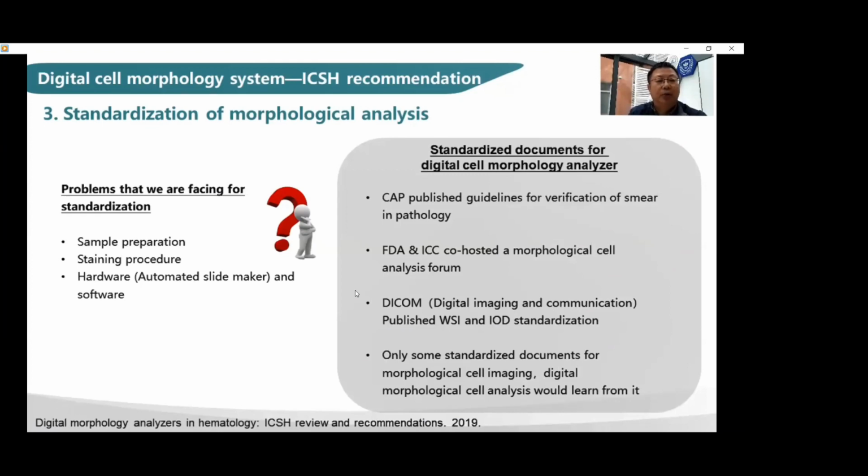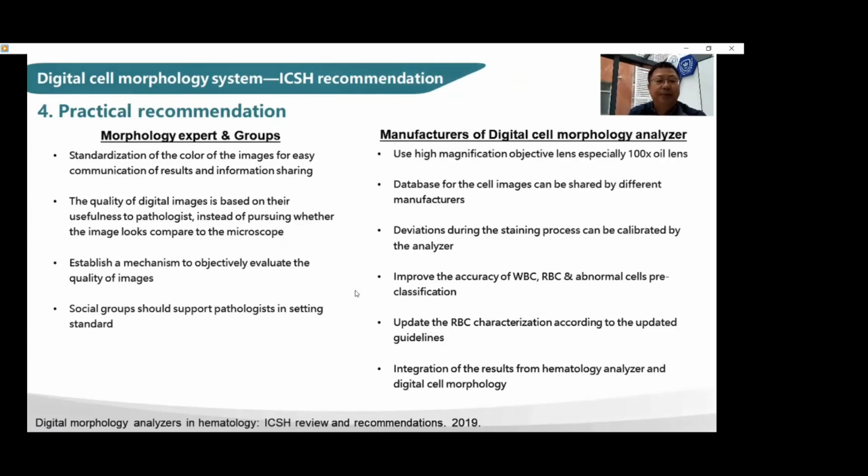Another part is the standardization of the morphological analysis. And the problem that we are facing for standardization is that we still need to do more standardization in sample preparation, staining procedures, the hardware, including the automatic slide maker, and the software. On the right side, we show you the standardized documents for digital cell morphology analyzers. For example, CAP published guidelines for verification of smear in pathology. FDA and ICC co-hosted a morphological cell analysis forum.